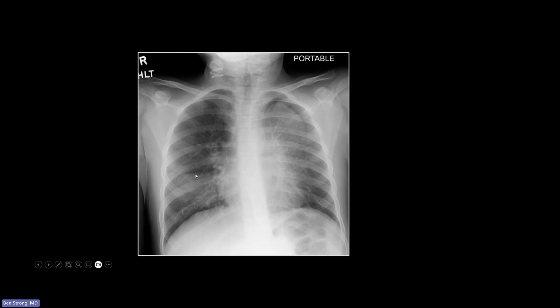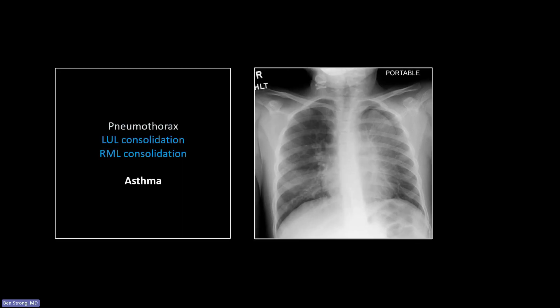The other interesting thing is there's right middle lobe involvement as well. When you have multifocal consolidation with potentially atelectasis and potentially a pneumothorax, that is acute asthma. These patients get bronchial plugging and mucus plugging, which results in atelectasis appearing as consolidation on X-ray. It can also cause pneumothorax — these patients are struggling and creating a very negative pleural pressure, which can pop any irregularity in the visceral pleura and result in a pneumo.